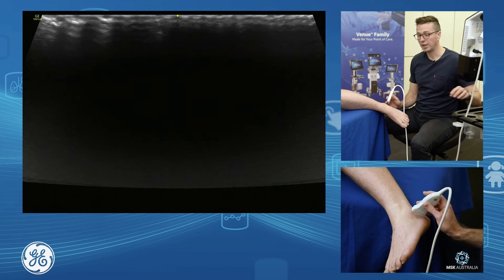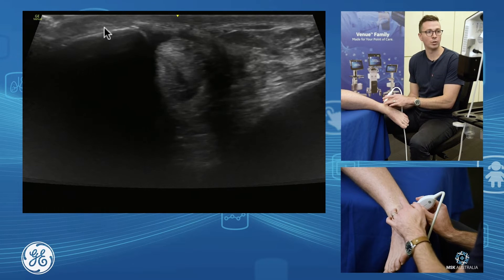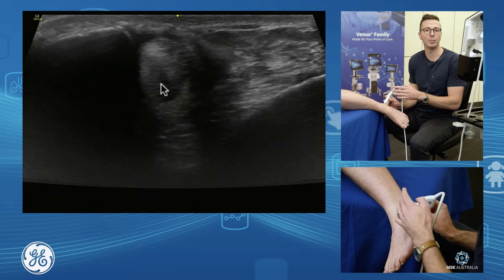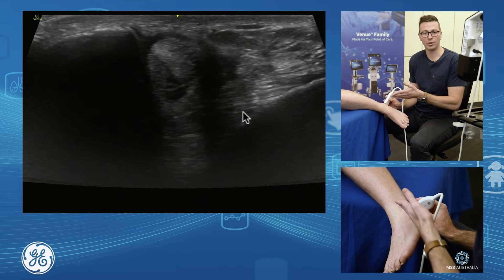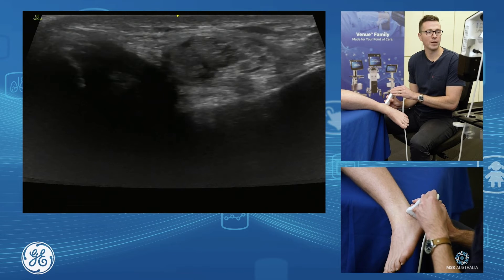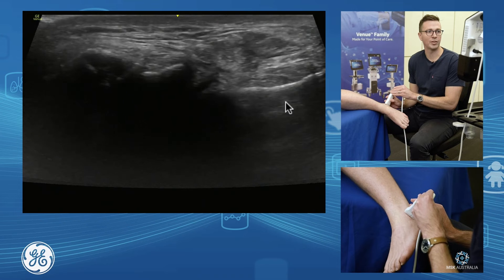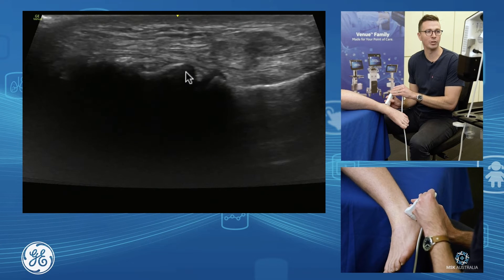The other joint we want to assess is our subtalar joint. We'll grab our fibula, have a look at our peroneals, and come down. We have our fibula and our calcaneus. Now I'm going to bring my probe just towards the distal foot, following the calcaneus. We've got our fibula, the calcaneus coming towards the front, and we see our talus come into play — here's our subtalar joint in through here.